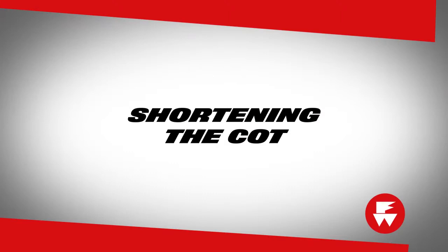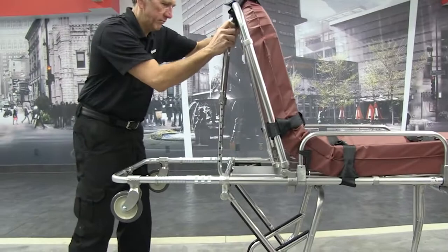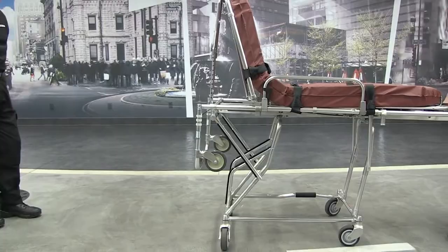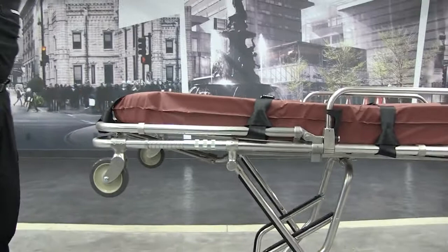The fold-down frame can be lowered to shorten the cot for maneuverability. First, raise the backrest to its highest position. Slide the lock sleeves back as far as possible, then push the frame down. To return the frame to its unfolded position, raise the frame. The lock sleeves will engage automatically.